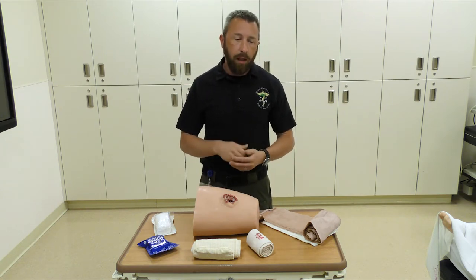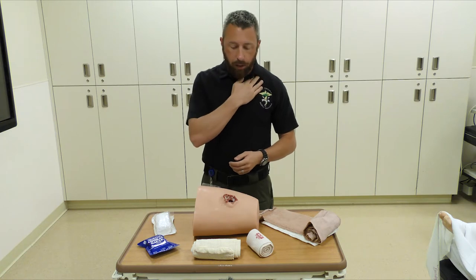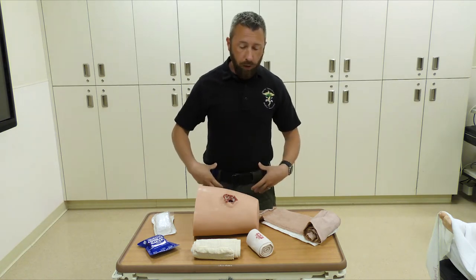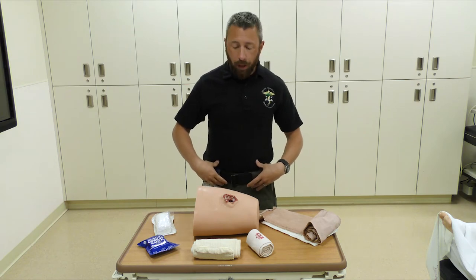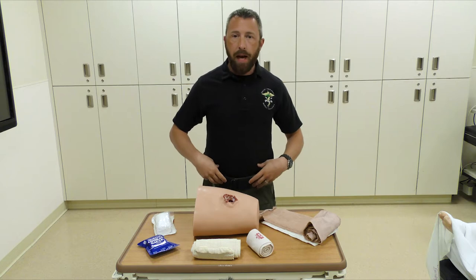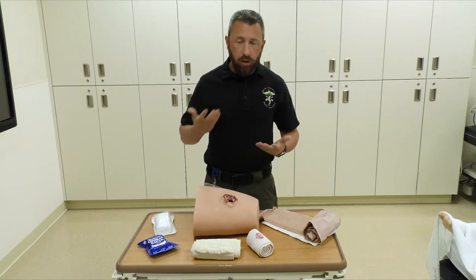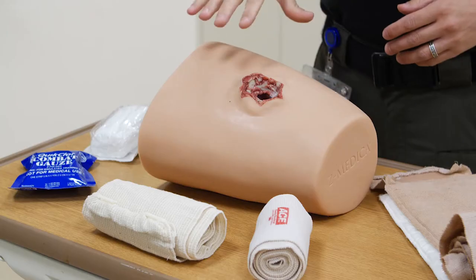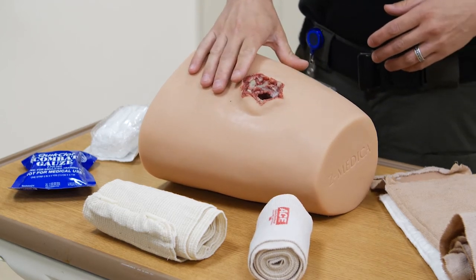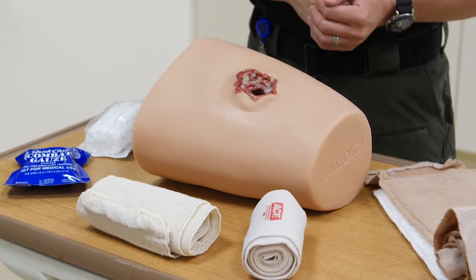Typically, anything in the shoulder, up near the neck, as well as the groin — areas where the arteries run closer — are areas that are going to be wound-packable. We don't typically tell anybody to pack anything above the belly button or into the chest cavity. So this wound packer, we're going to say, is in the groin area and we'll practice packing a wound with that.